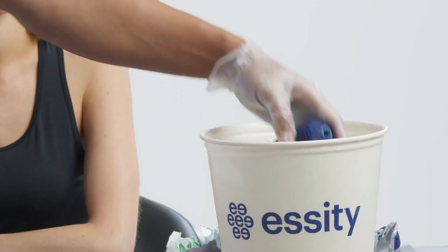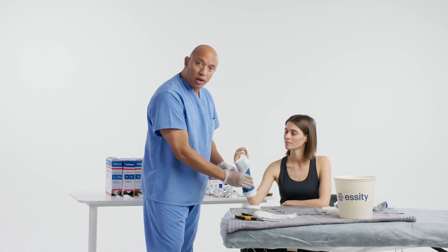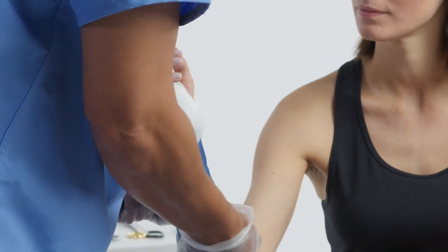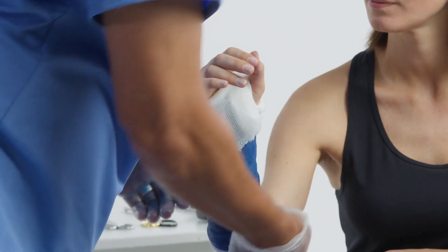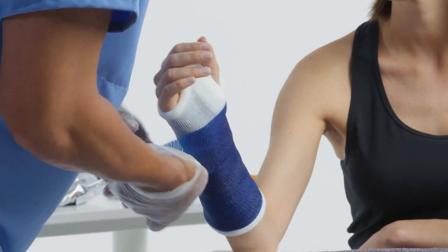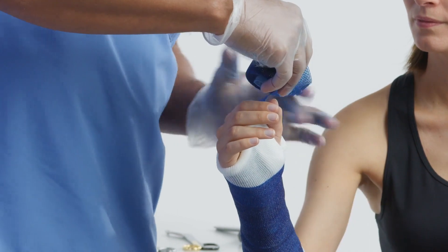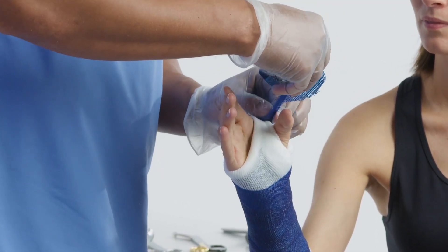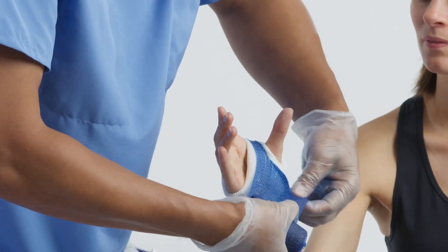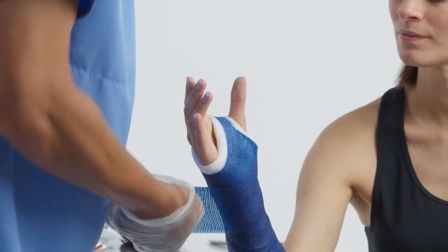Now let's add our last roll. I'm wringing this out a lot more because on this particular roll, I already have my mold that I really want, and now I can put this on without worrying about the patient moving too much. Here we go with our cuts again — the little J cut. Open your hand up just a tad, and I'll fold over the little fish-bone edges that stick out and can cause patient irritation. Some people will put moleskin or some type of adhesive edger on the edge, but you want to limit those sharp edges as much as possible.